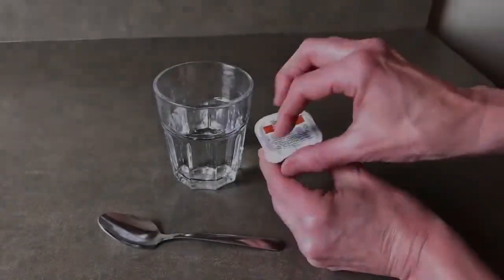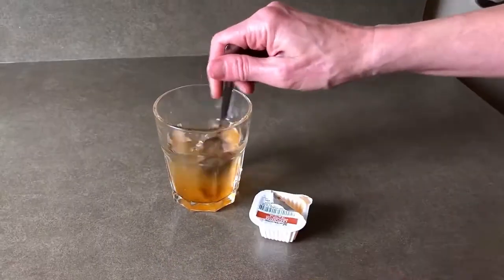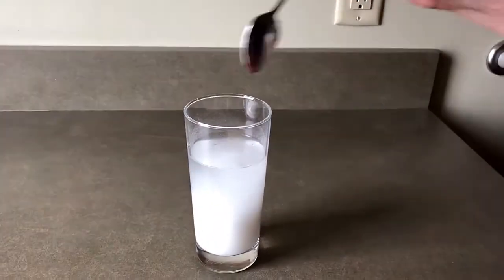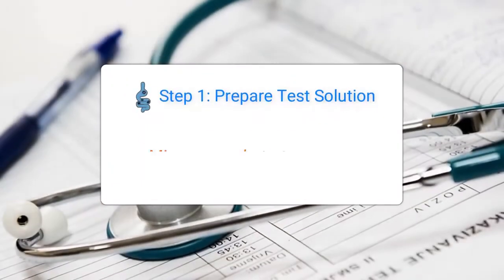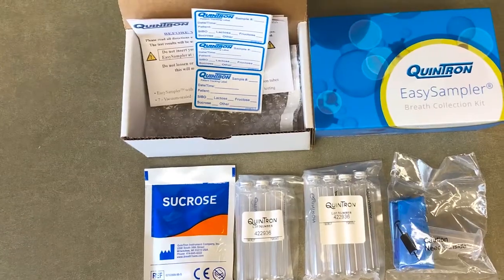For some breath tests, the first step is to prepare the test solution. For others, it is to set it aside until after collecting your baseline sample. Please check and follow the instructions found within your breath test collection box. It is important that you do not drink anything yet — set aside your sugar substrate for after your first baseline breath collection.